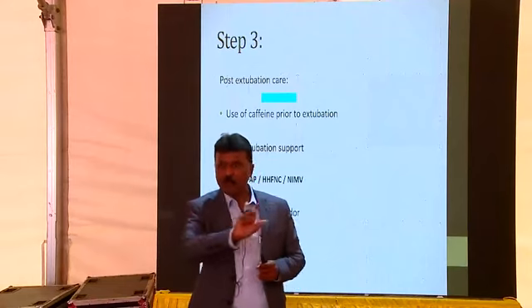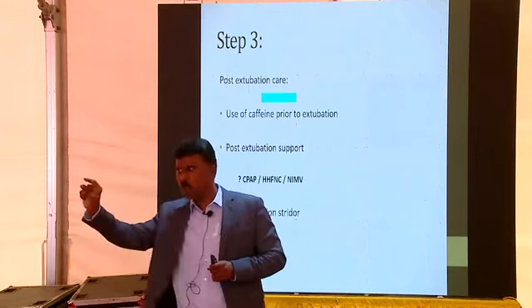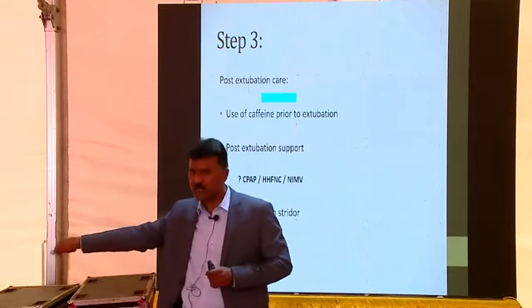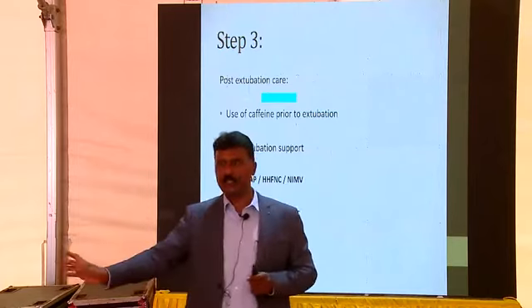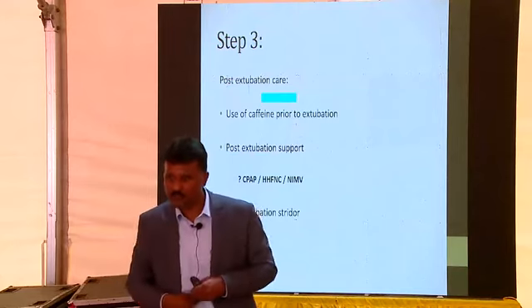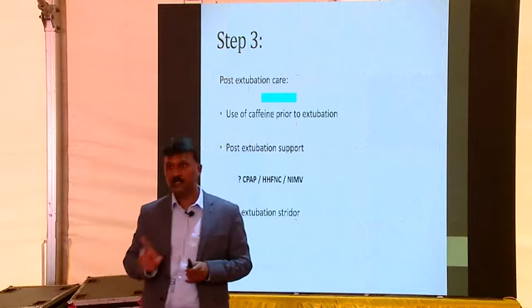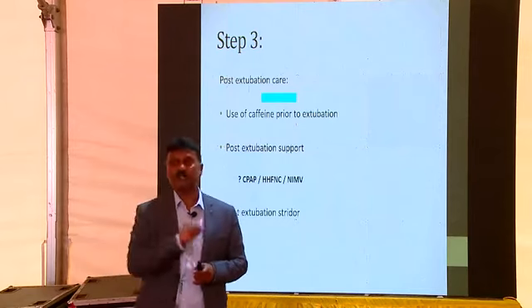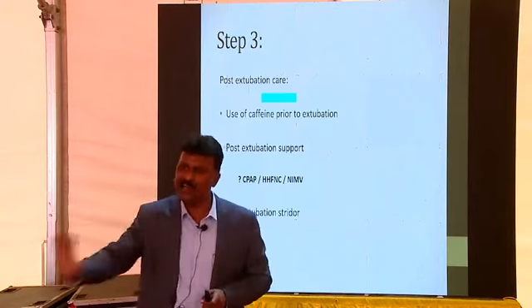It's like in SIMV mode, if your flow sensor is not working, it is actually IMV. Your mode says SIMV, the flow sensor is not working, it is IMV. Practically, it is not synchronizing at all. Same thing here. Once I put on NIMV, though it says SIMV, unless I have an option of an abdominal capsule or my ventilator is able to predict the breaths and give synchronization, virtually whatever mode you set, it is going to work like IMV only.